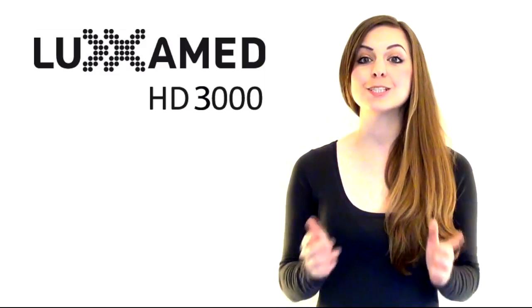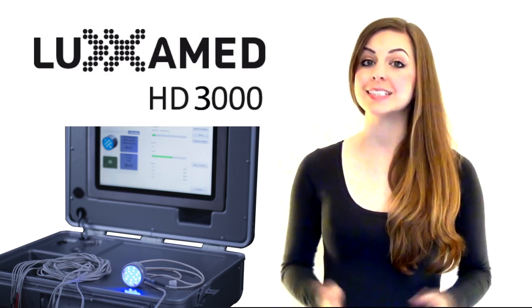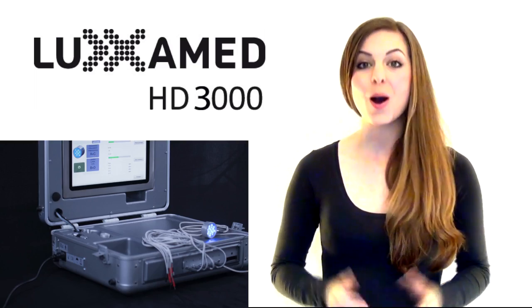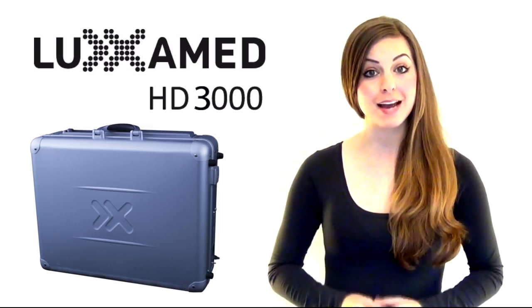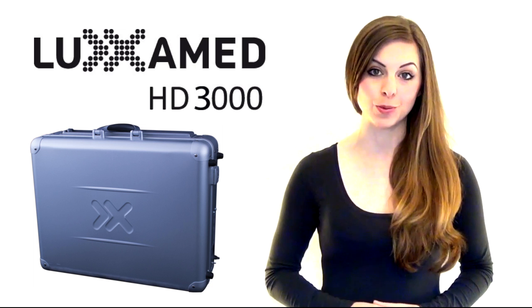Luxamed's new model combines mobility, design and efficiency in a single unit, optimizing the delivery of pain therapy in the world of professional sport.